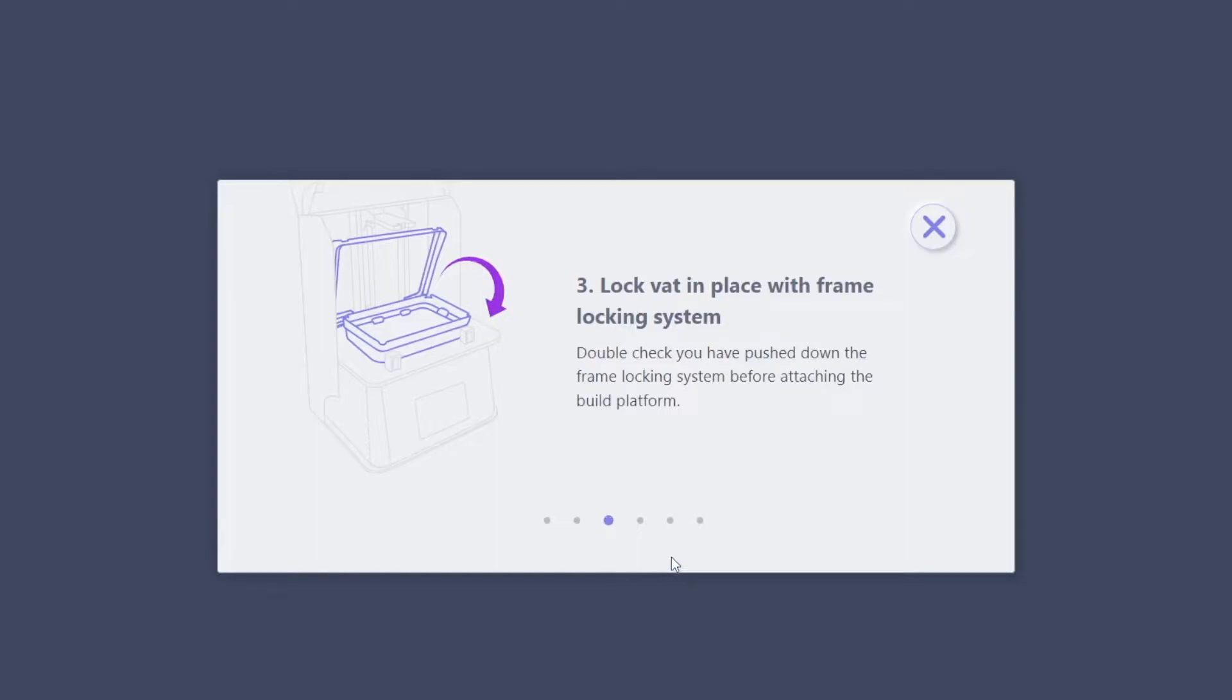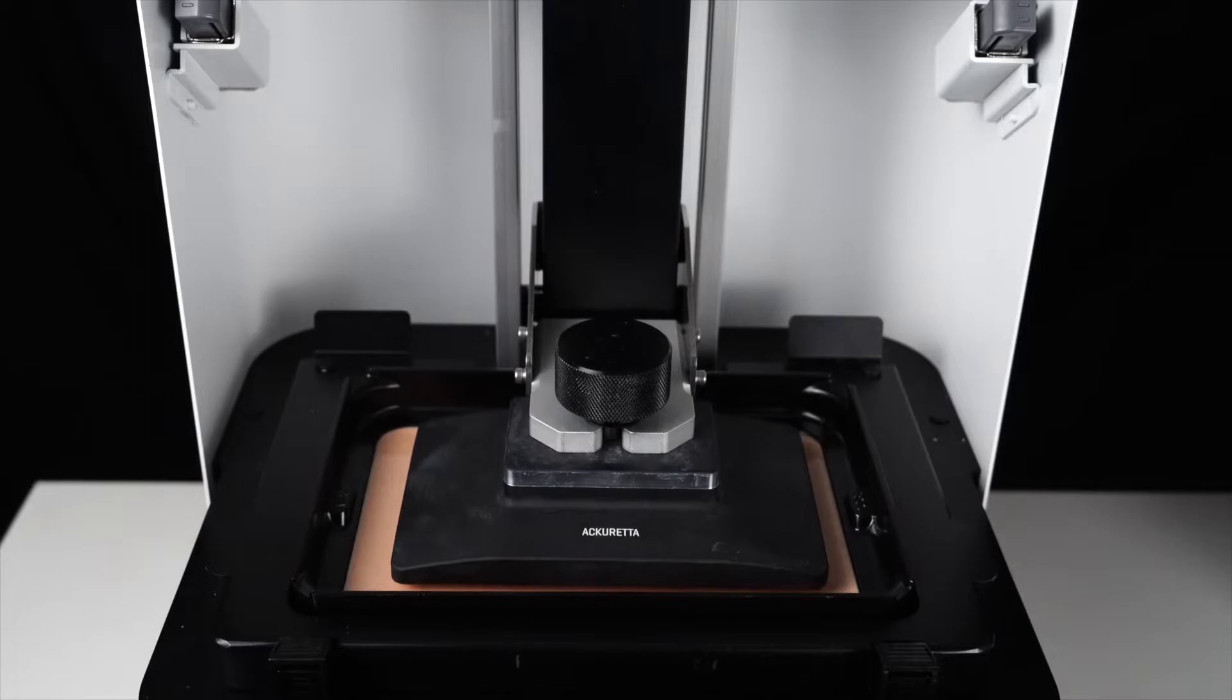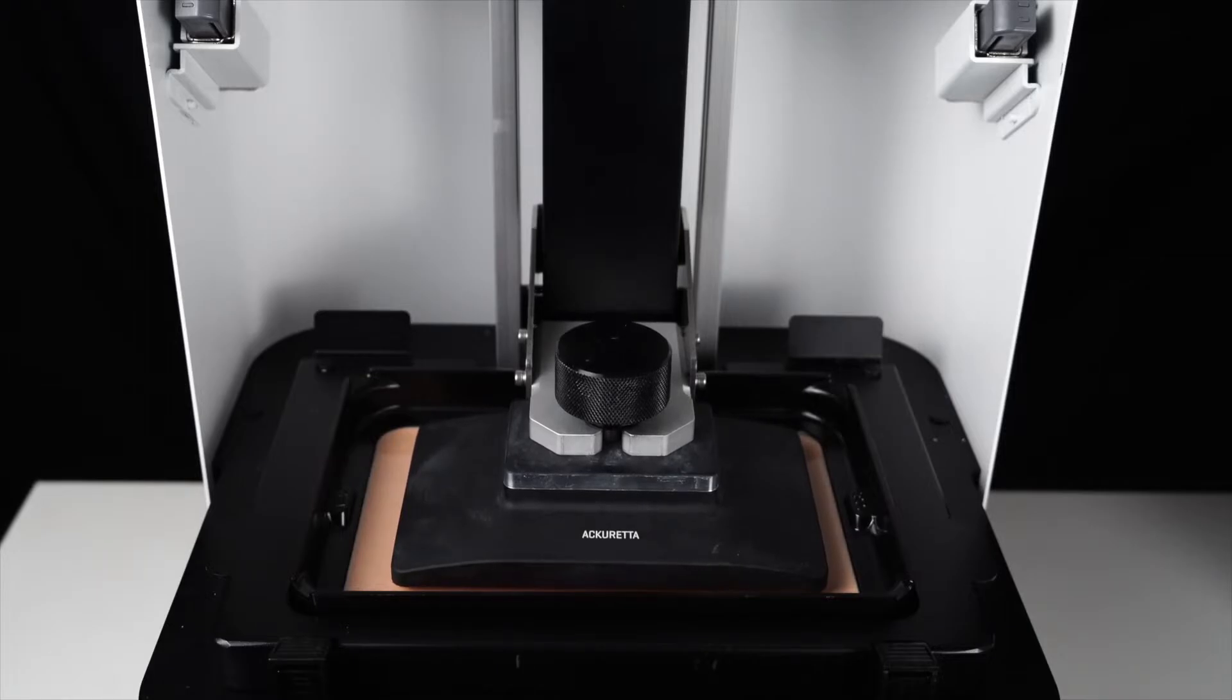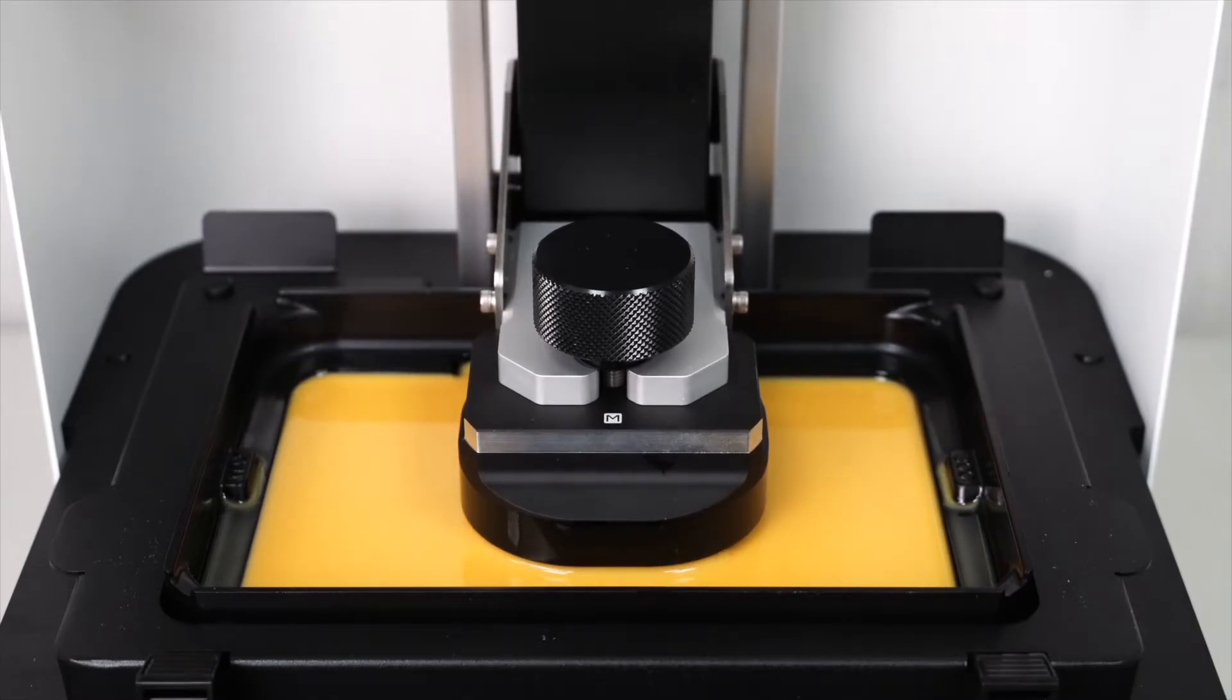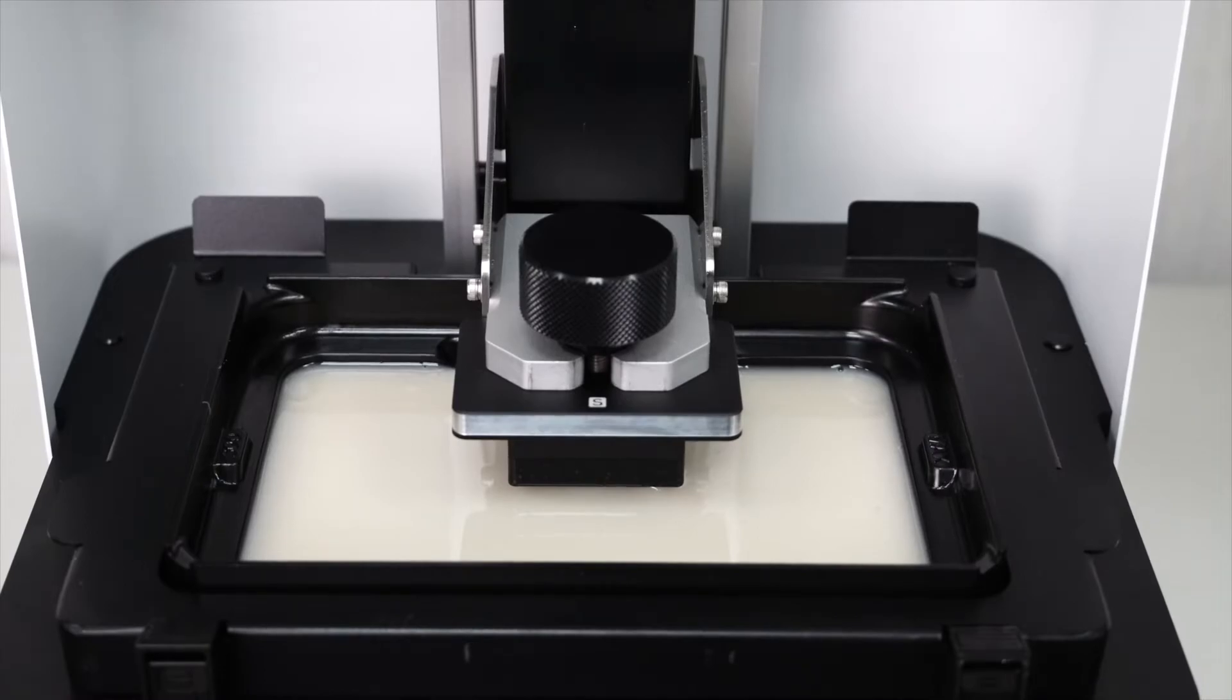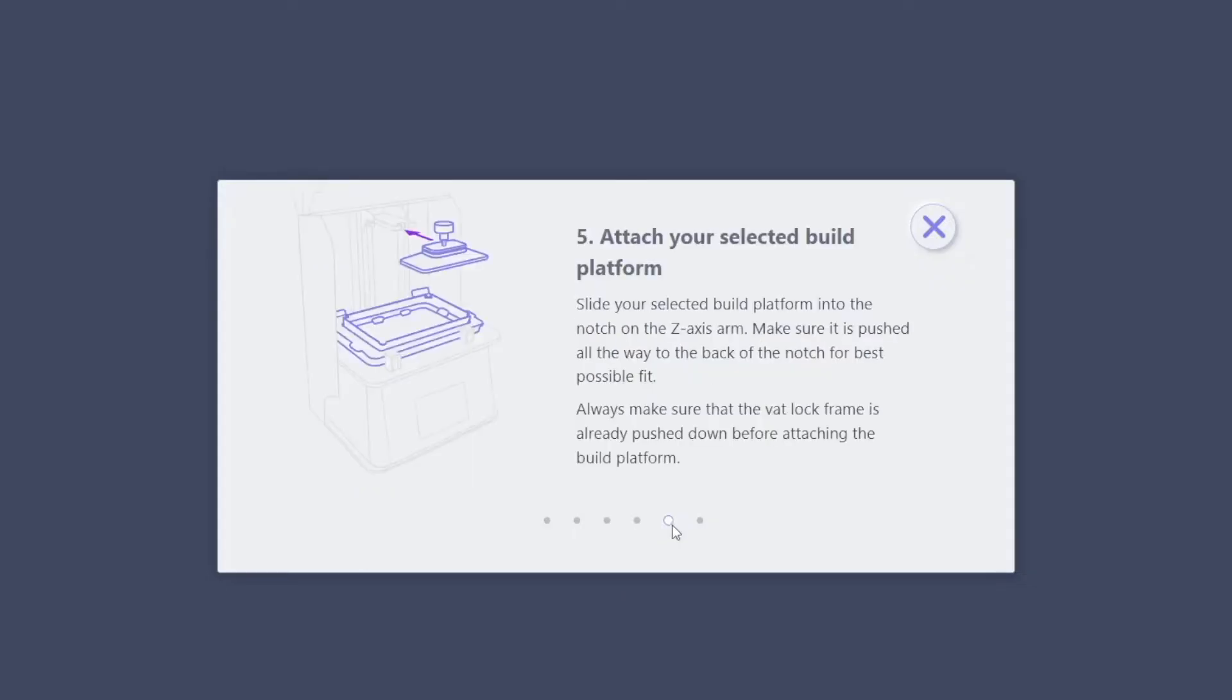Confirm that you have chosen the correct build platform. There are now three sizes available: the standard platform, the medium which we are using now, and the small build platform. Attach the build platform securely on the Z-axis arm and lock it.